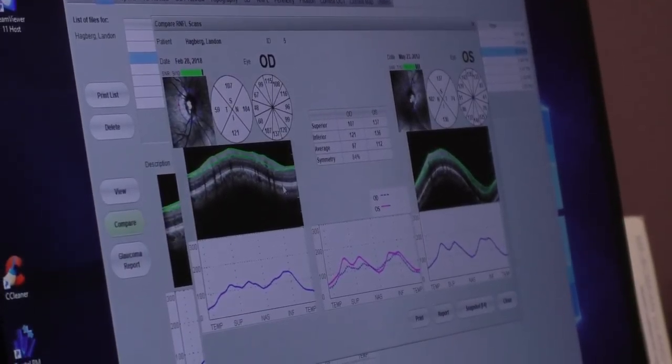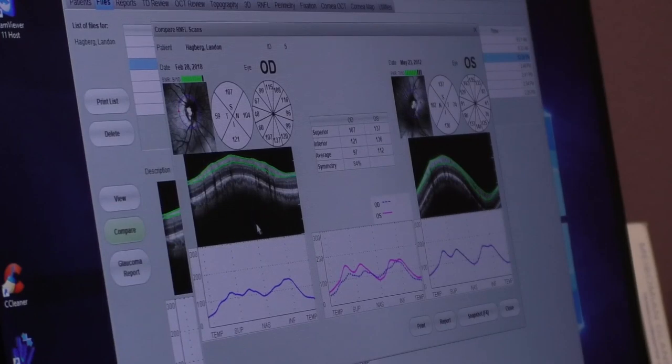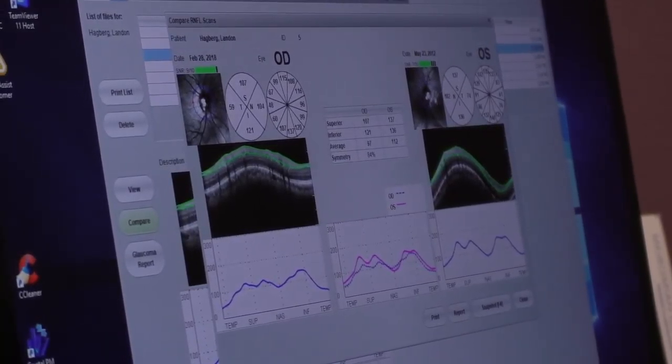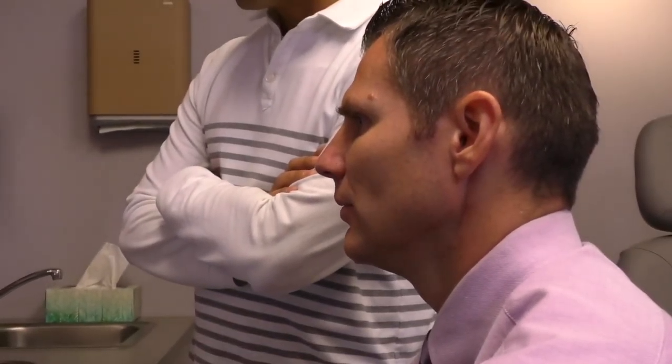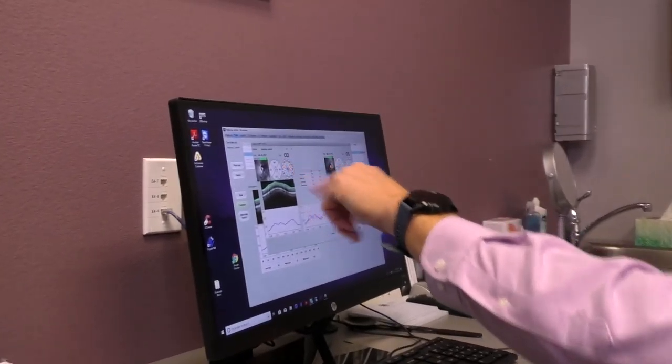Mr. B, what we're looking at here is that scan we did in the first room of the nerve fiber thickness. Looking at today's results, the biggest thing we're going to look at is if your optic nerve is the same — right eye comparing to left eye. That's the key thing. We want them to look very similar, about 80% or higher symmetry. And your thickness on the bottom part of the nerve on the right eye and your left eye thickness looks great.